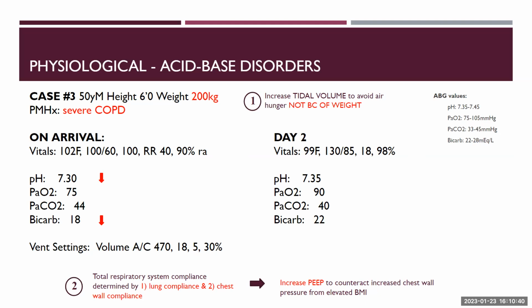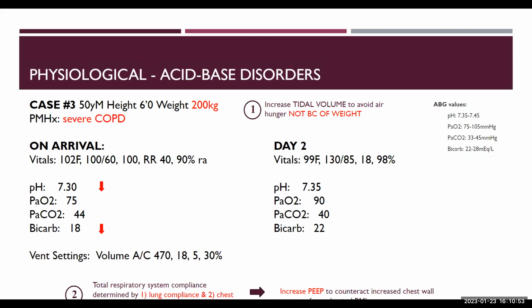If you have to raise the PEEP to account for that and to make the patient more comfortable, do you risk, I might be thinking about this wrong, but do you risk over oxygenating the patient if that's going to increase the oxygenation by increasing PEEP? Do you have to lower the FiO2 as well a little bit? You may.